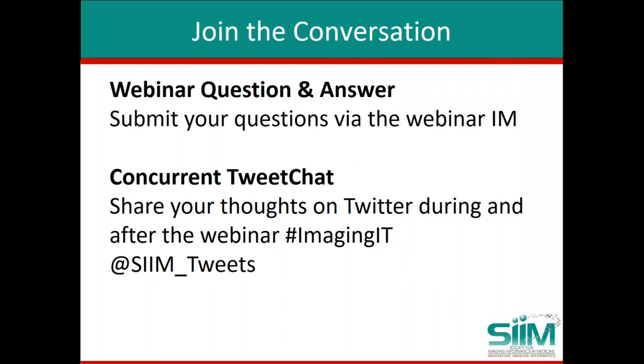So our plan is now to integrate with PowerScribe, and we are functioning as the RIS and integrating with PACS systems like Orthanc and viewers like Cornerstone. We've not had a problem with that. For example, Orthanc, and I shouldn't speak for Orthanc, but they have a plugin and a form that you can use to send a modality worklist, and that's supported. And using DICOMweb, it's easy to integrate and view images using Cornerstone.